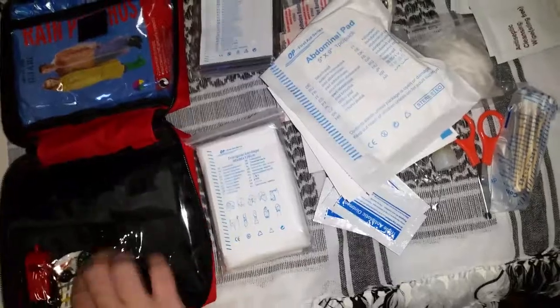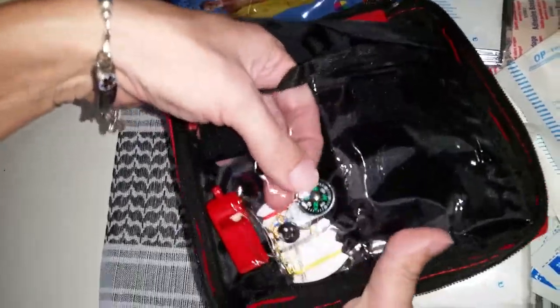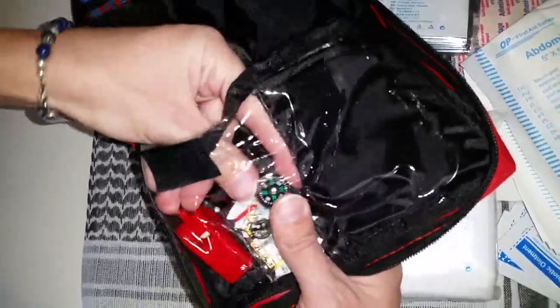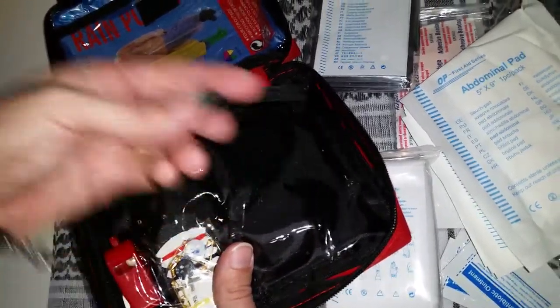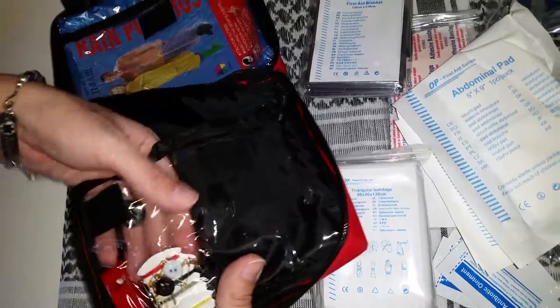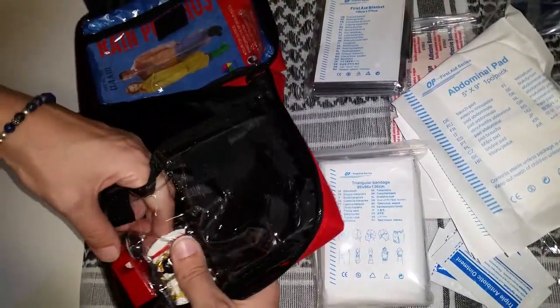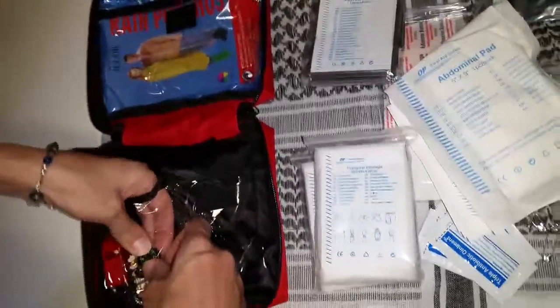Oh look, I missed the little compass — there's a little compass attached to that bit of vinyl, and you can pull that out. So yeah, there's a lot of stuff in here for the money. Definitely worth it. That's a good little kit, so hope that helps.